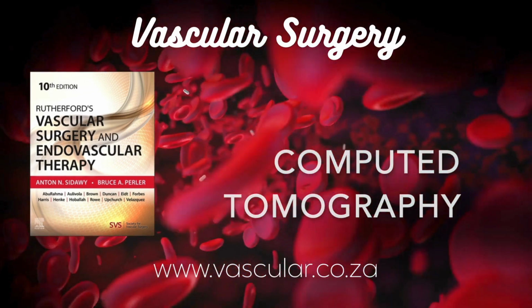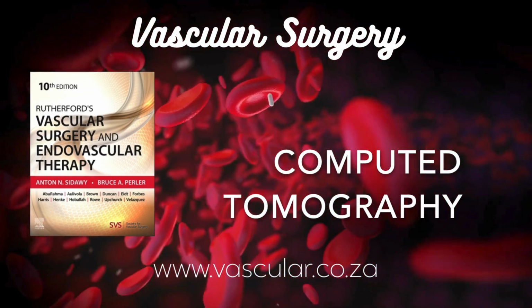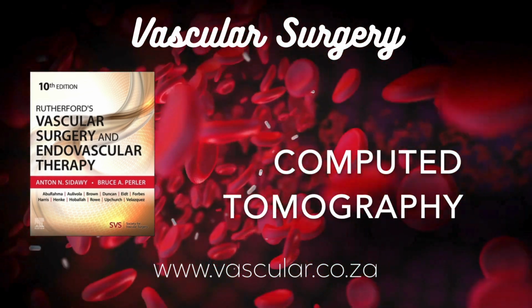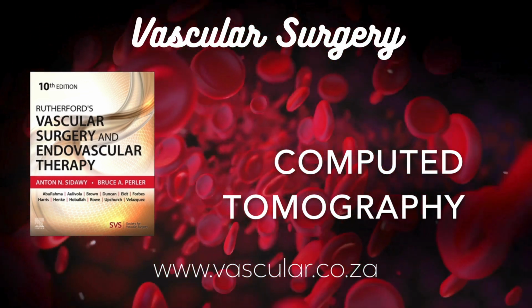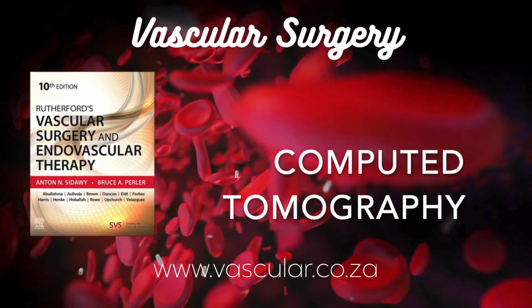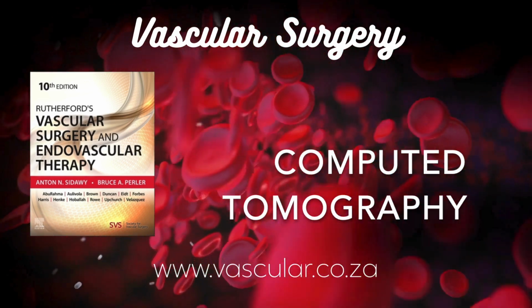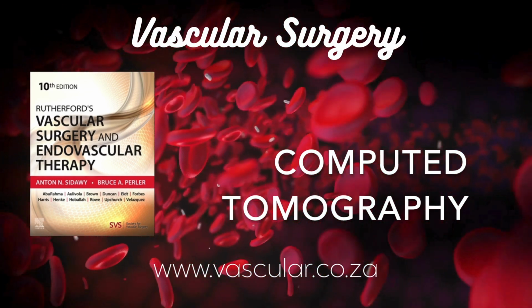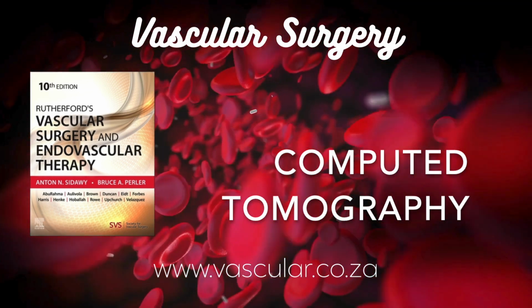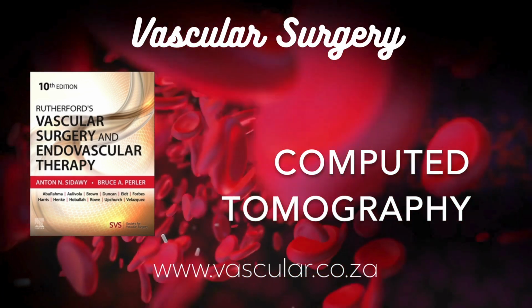structures. Okay. Then there's windowing. Window width, window level. Sounds like photo editing. It's very similar. It's how you control the brightness and contrast of the image displayed on the monitor. It doesn't change the underlying HU data, just how it's shown. How does it work? The window level, WL, sets the center HU value that will be displayed as mid-gray. The window width, WW, sets the total range of HU values around that center that will be spread across the entire grayscale spectrum, from black to white.